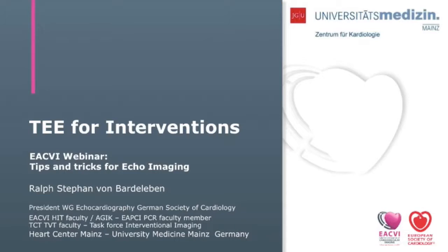During this interactive webinar, we'll be dealing with the role of TOE in different kinds of structural interventions, such as mitral clip, TAVI, left atrial appendage closure, and so on. The aim of this webinar is to update you regarding the utility of the 2D and 3D TOE in various types of structural interventions, showing the incremental value in some points for the 3D over the 2D TOE, and giving some practical tips on how to acquire and display the necessary 3D volumes, and answering some of your questions according to the time regarding this modality.